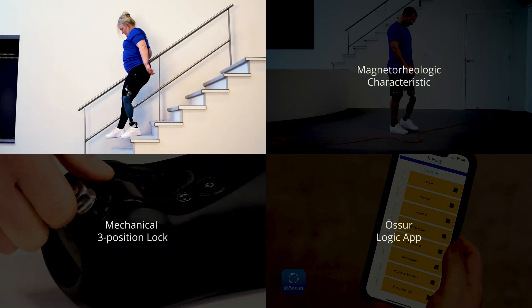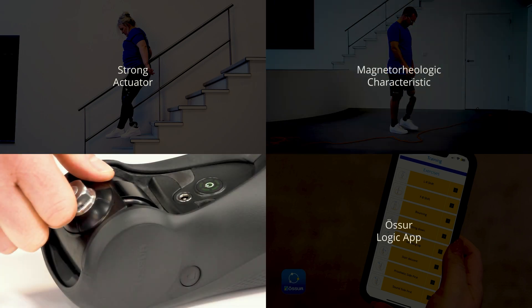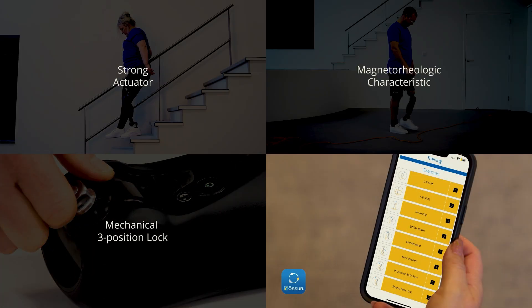The strong actuator provides powerful and safe support during stance phase and activities such as ramp or hill descent and sitting. The magnetorheological characteristic also provides very lightweight, low-energy inputs during swing phase, and is highly adaptable with automatic recognition for terrain and activities such as bicycling. The mechanical three-position lock gives people absolute confidence where they need a fully locked prosthesis, and the Ossologic app allows users to see exercises and activities that will promote better functional outcomes.